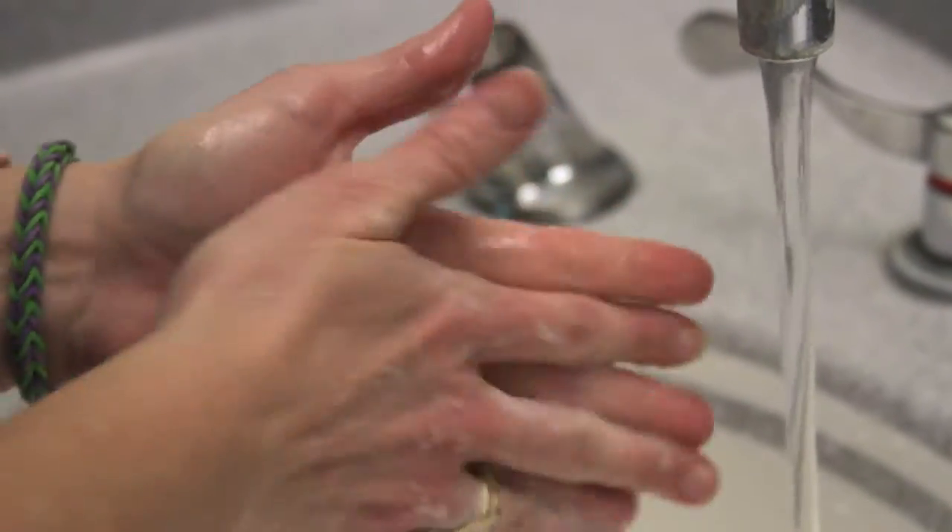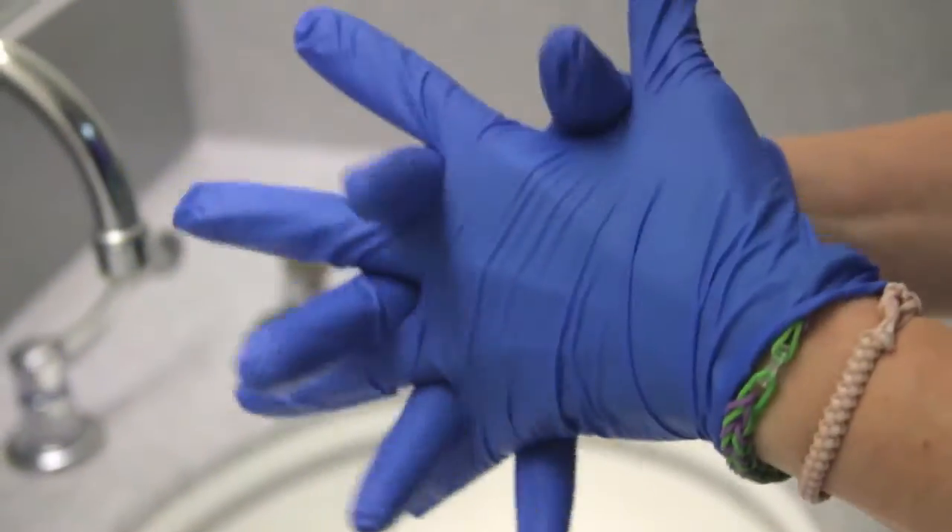Welcome to Reconstitution Review, where we'll go over how to reconstitute with various infusion devices. With all factor reconstitution, it's important to let the factor get to room temperature. And while you're waiting, wash your hands. When they're dry, put on your gloves to get started.